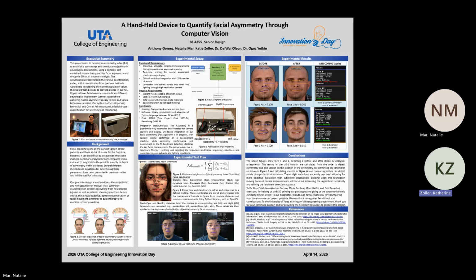So from the midline on figure 5, that black line down the middle, that is our reference point. For every landmark on the left and the right of the face, there is a distance, and that distance value gets plugged into that formula, and the formula basically calculates the difference between the distances from the left of the face to the right of the face.